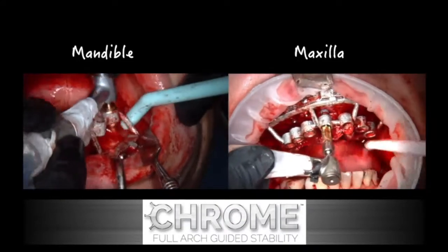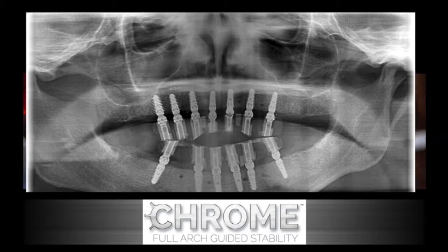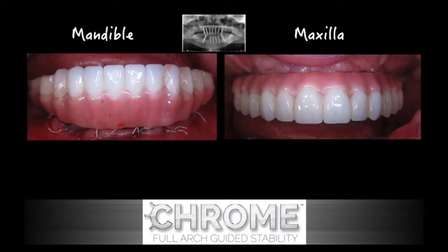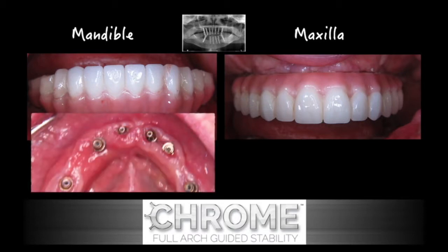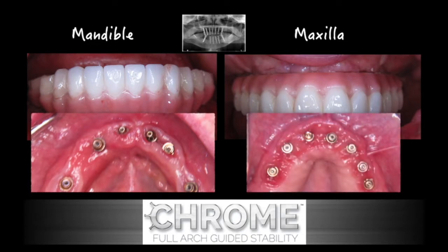Once all of the implants are placed, a panoramic radiograph confirms that the plan was met with the positioning of the guide itself, and you can see some of the holes left in the bone from the fixation pins. The prosthesis is then delivered, again using the chrome guide fixation and Swiss locks to assure the proper fit and proper bite. Here you see the post-op with the multi-unit abutments on the left and right and the soft tissue healing.